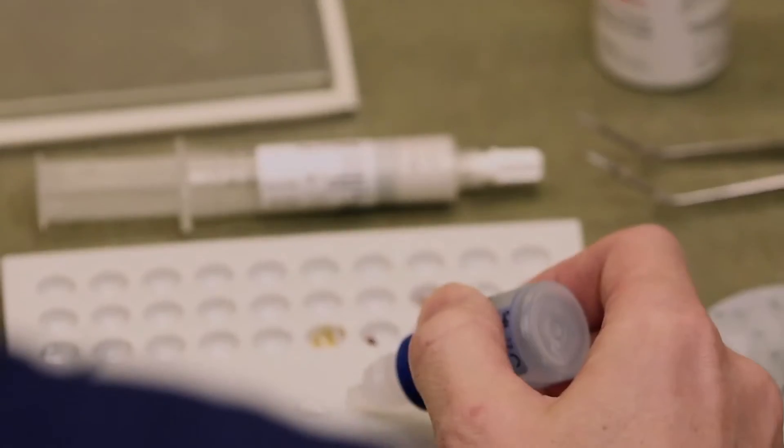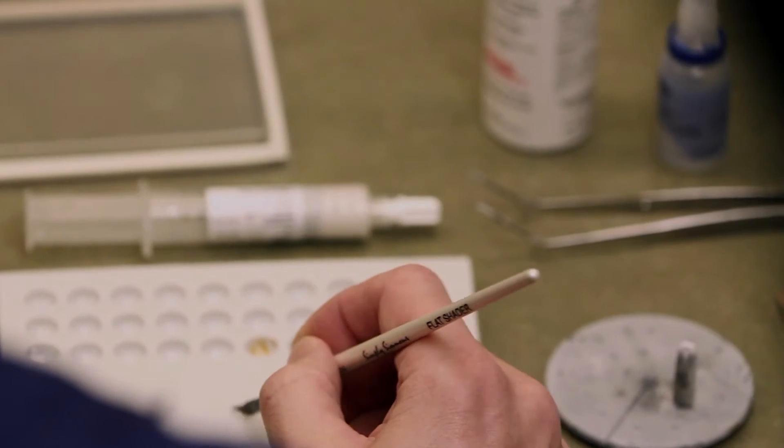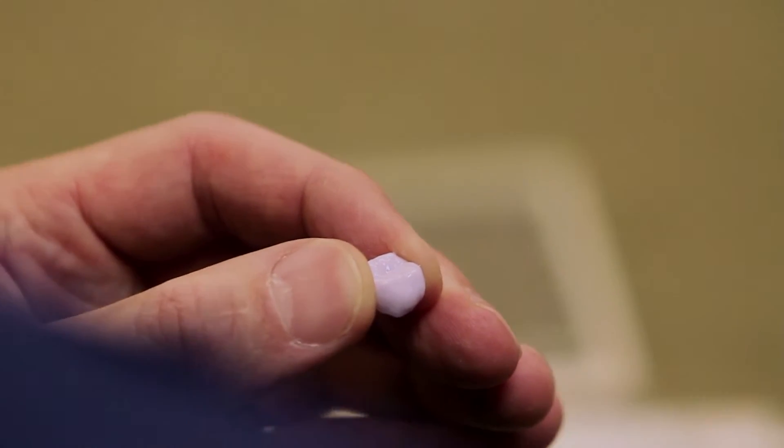We're ready to press play and send it to the mill. We have some glaze here and we have to slightly dilute it with this liquid just a tiny bit. We characterize the occlusal with stain to give it a third dimension and make it not look flat.